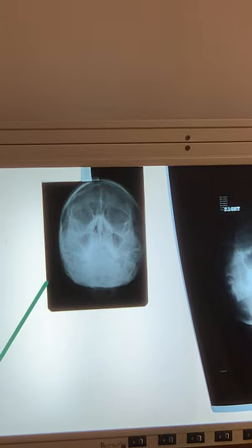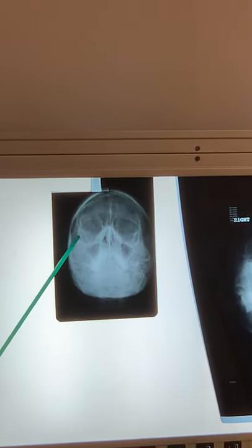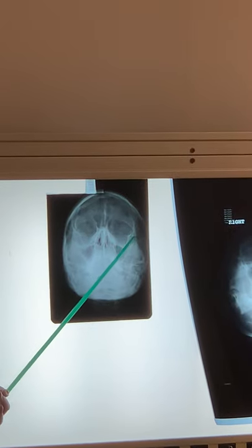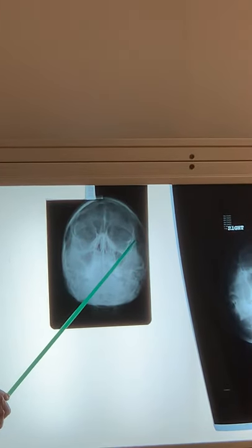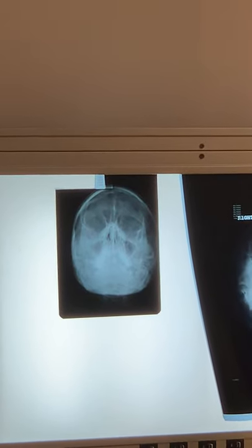It's a little rotated, huh? Because if I go from the lateral margin of this orbit to the lateral margin of the skull, and then go from this to this, see how much further that is away? Okay, so it is a little rotated. What about tilt?